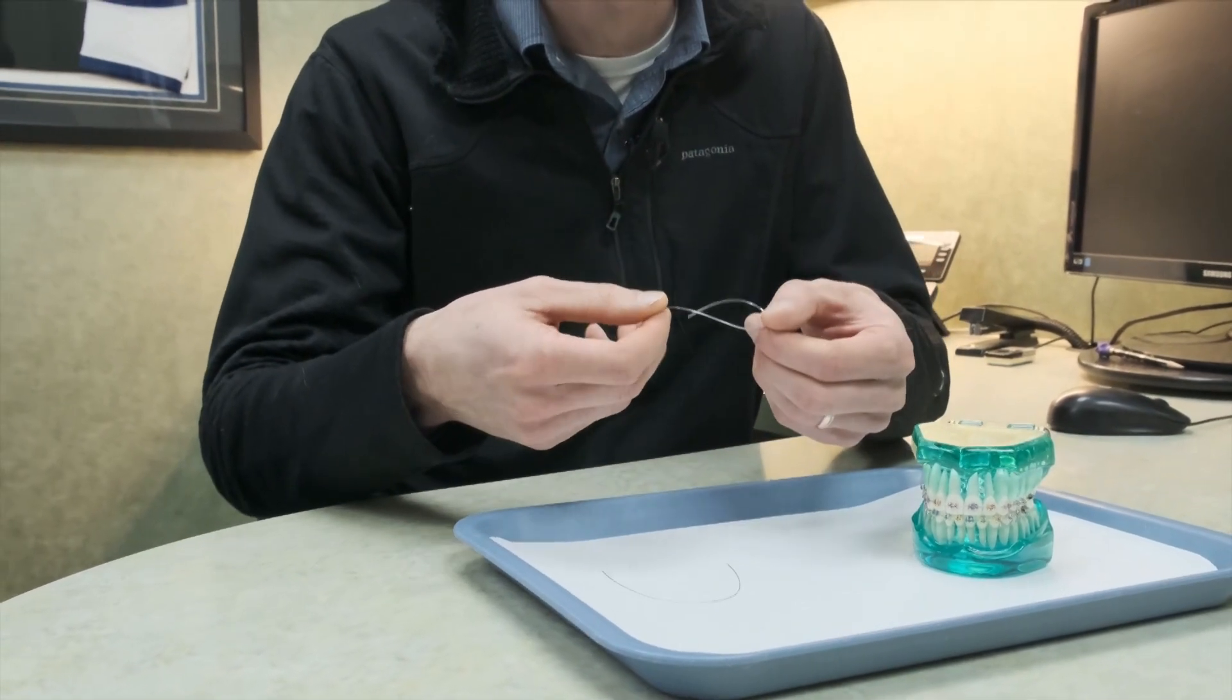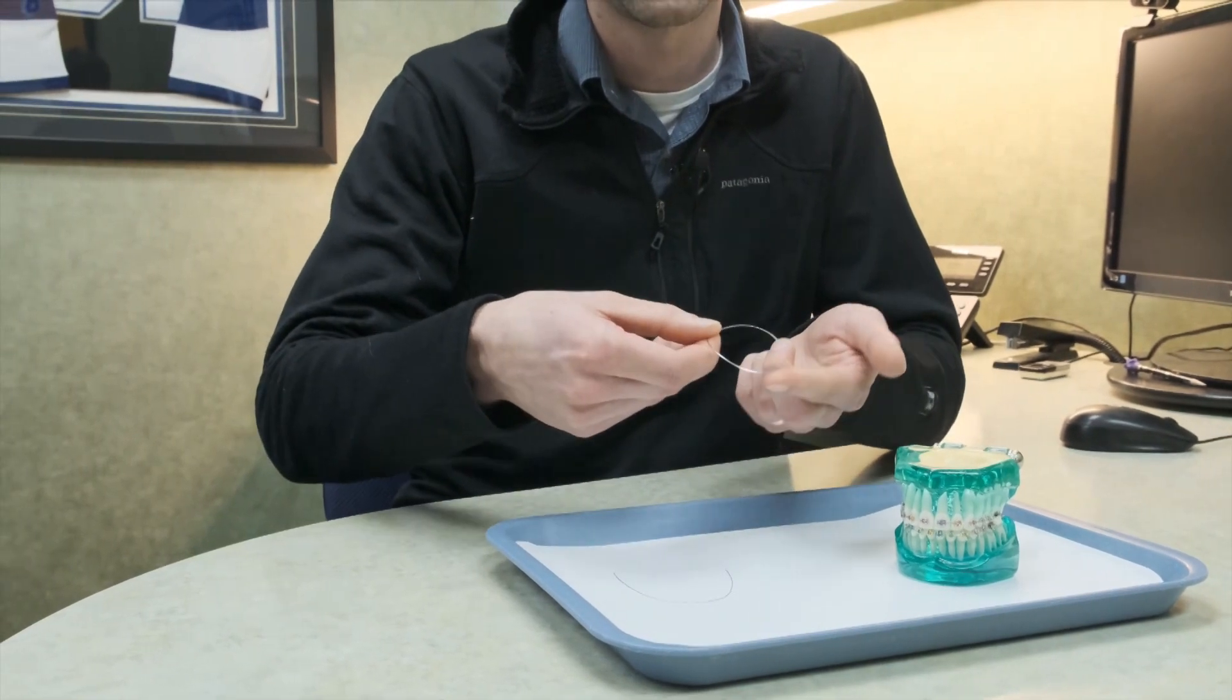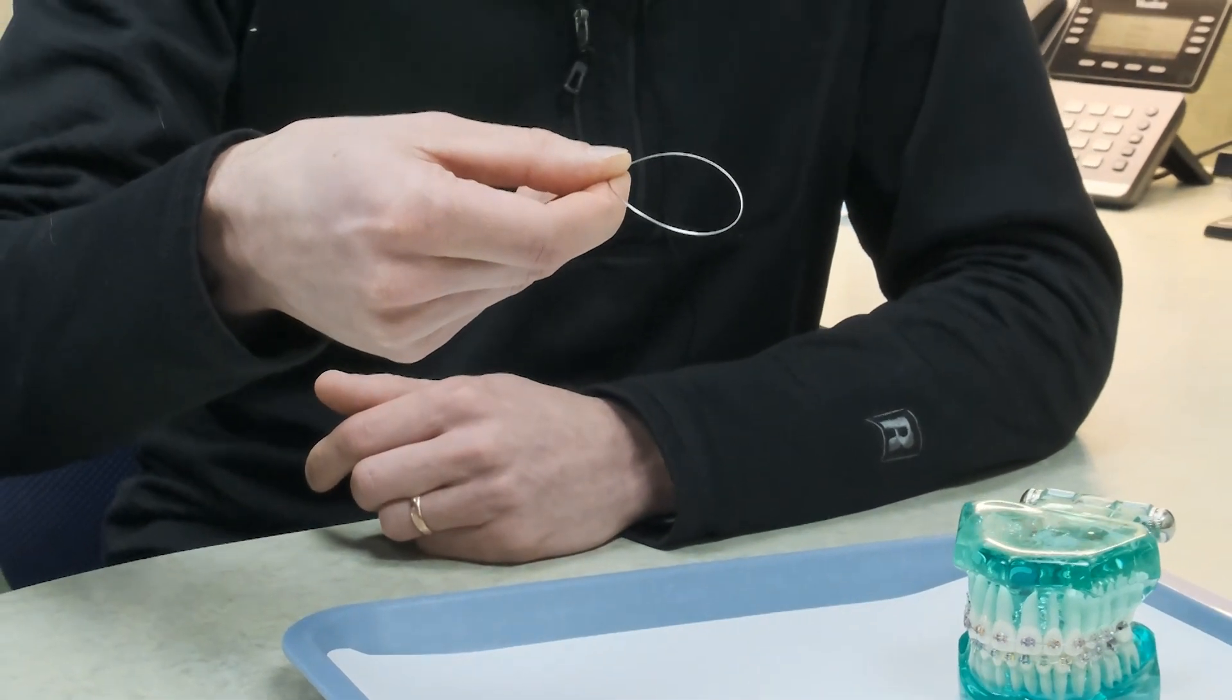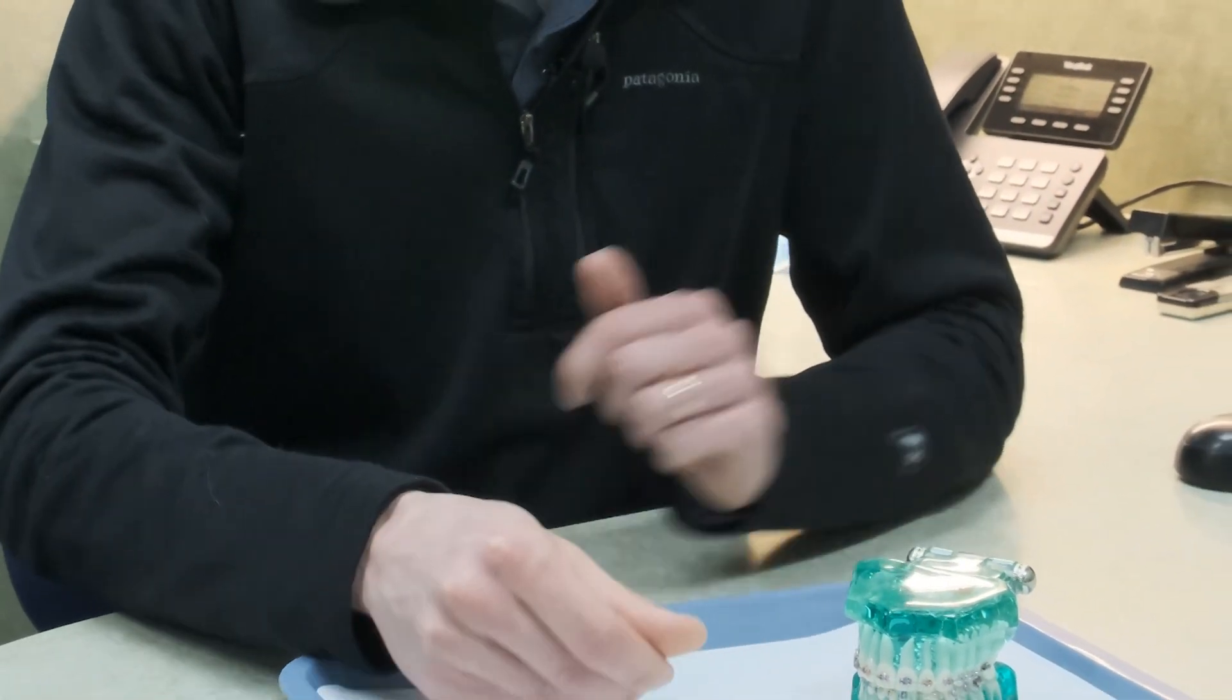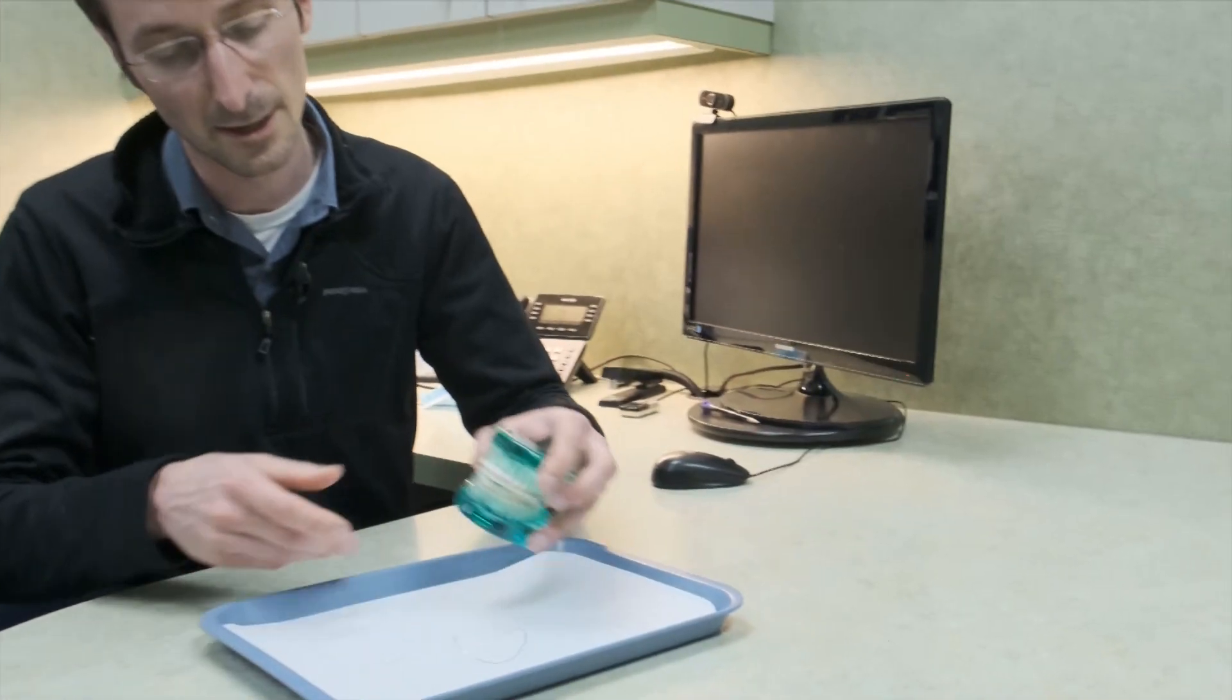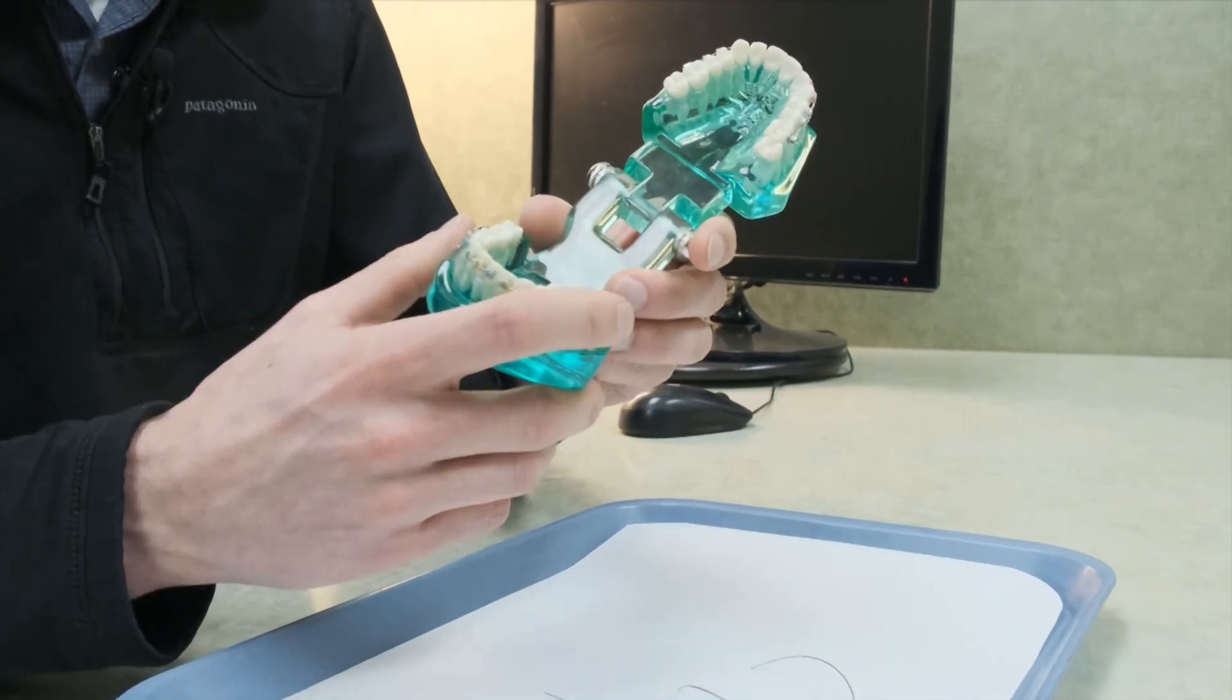What this wire does is it helps correct deep bites. When we tie it in, we're going to tie it in where it's flat, and then the wire is naturally going to want to push down on these bottom teeth. You can see it bounces around a little bit, but that reverse curve is going to help level out our bite.